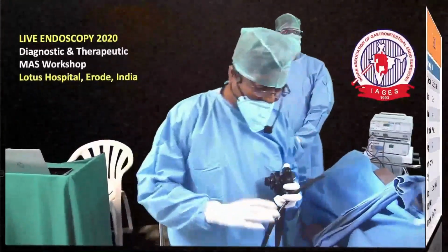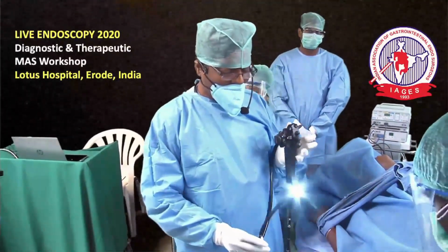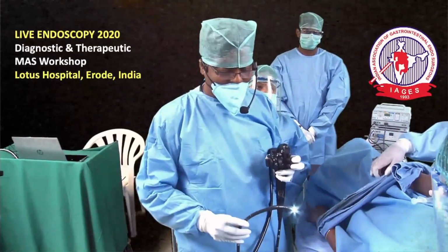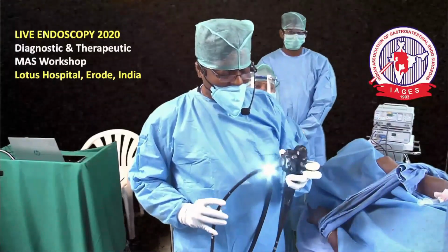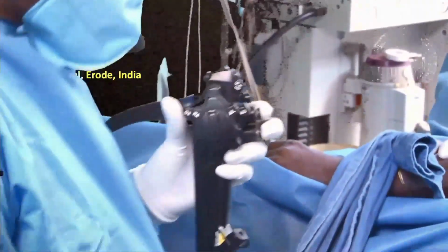You see my stance again. Stand at ease. Hold it comfortably. Make a gentle curve with the big wheel towards you like this. So we are ready to go. So these are the 3 things, and we already know what each is doing. Each finger is allocated to control the buttons and wheels, which we already know from our first module.